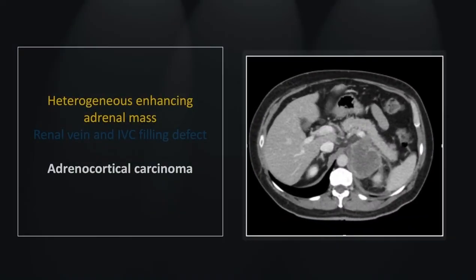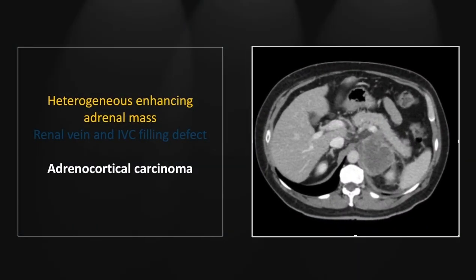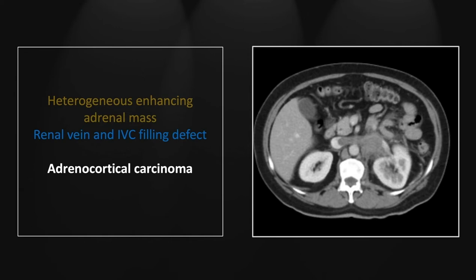Our next case is an adrenocortical carcinoma. The adrenocortical carcinoma is on that list of angioinvasive tumors as well, and it is important to distinguish from renal tumors as they frequently can be confusing. Here we see a suprarenal enhancing heterogeneous mass. More inferiorly, you can see another enhancing filling defect filling and expanding the left renal vein, and crossing the midline to enter the IVC.